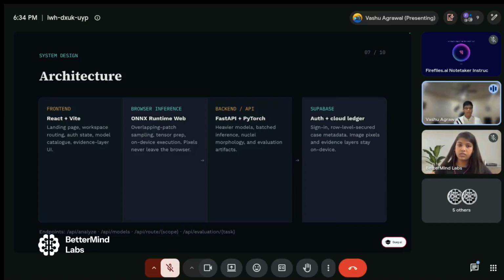And so I really wanted to emphasize user privacy and also user security, and so that's why I implemented an API with the backend. It is because low security websites often just have front end or weak backends, and so I really want to emphasize that by putting an API and Supabase backend, as well as my ONNX Runtime Web, which basically makes it so that the user pictures and the models are run locally. That way they can save on hosting, and also the fact that they'll be much faster depending on the computer.